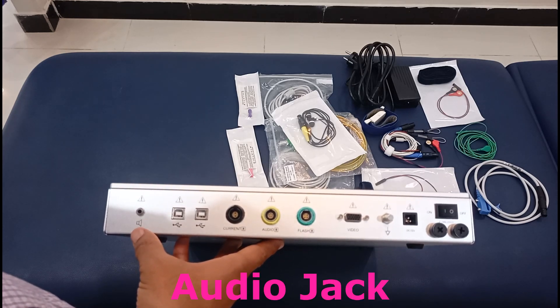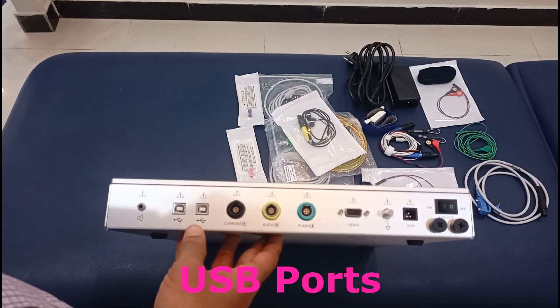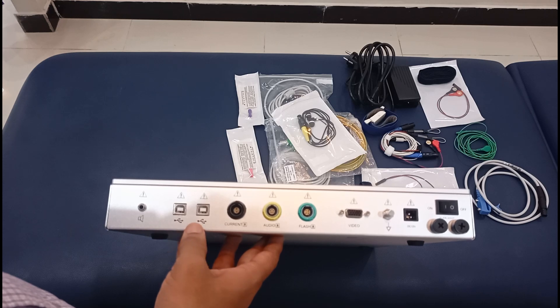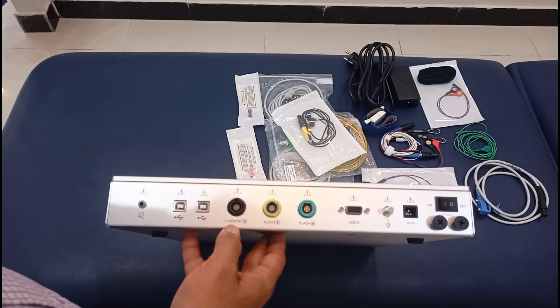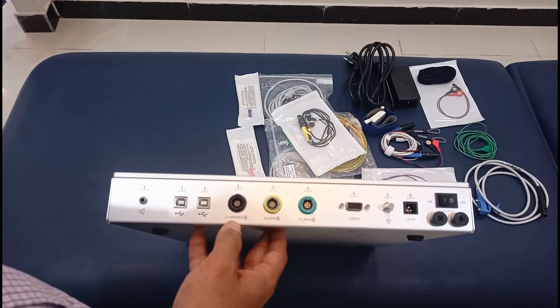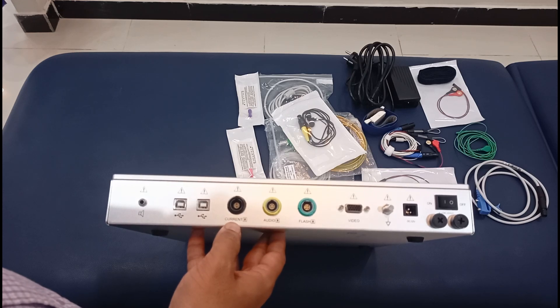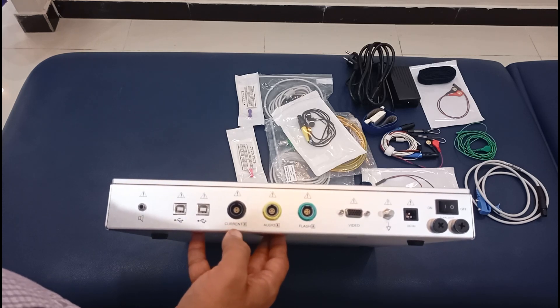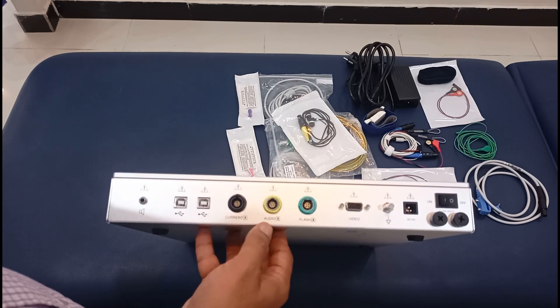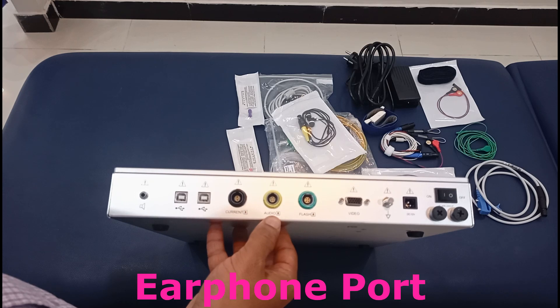This is the audio jack or audio port. These two ports are self-explanatory — they are marked with USB signs, so you connect the USB wires here to connect to your laptop. This port shows the current — it is the port for the electric stimulator and stimulating electrodes. The one on the right with the blue color, just below the green wire, connects here.